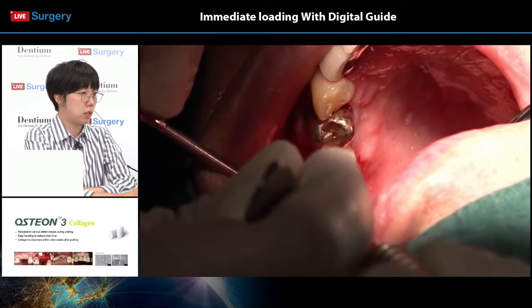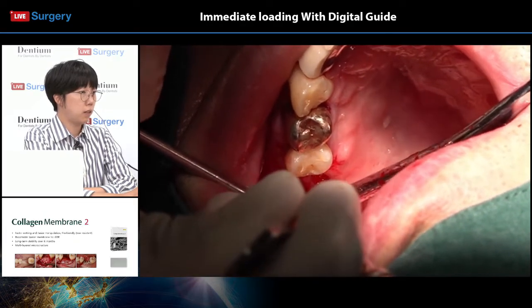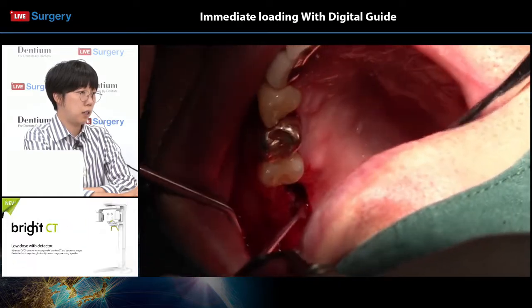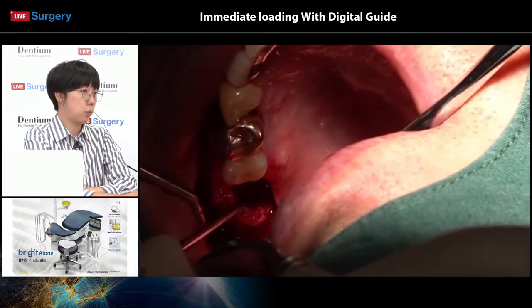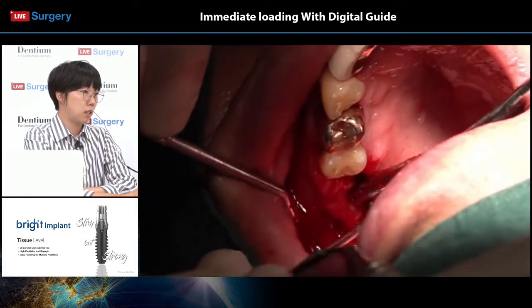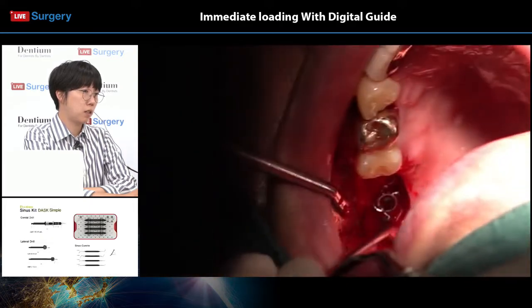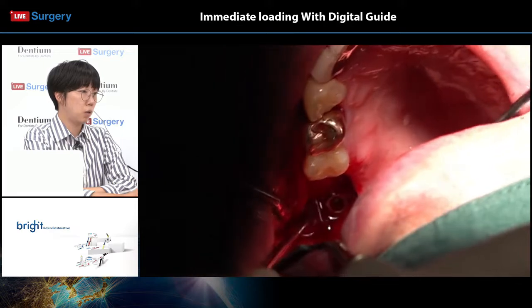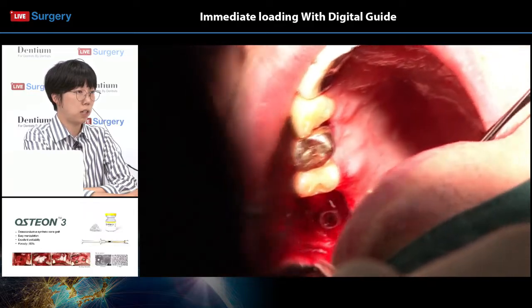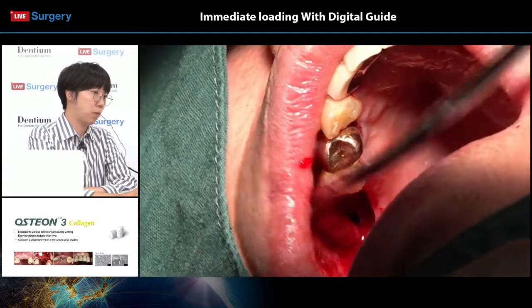The patient has a lot of bleeding. Now, even if this implant site was without any granulation tissue or inflammation because it was an edentulous site, an extensive amount of bleeding can still be present, considering the patient's medical history or the medications that he or she is taking. This patient, for instance, if he was taking aspirin before surgery, then this could have led to this abundant amount of bleeding.